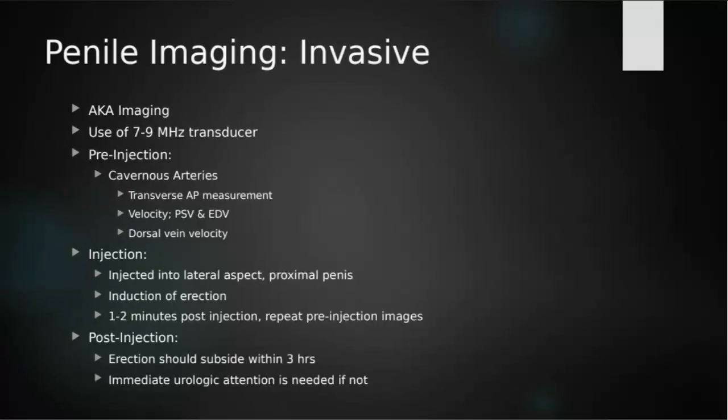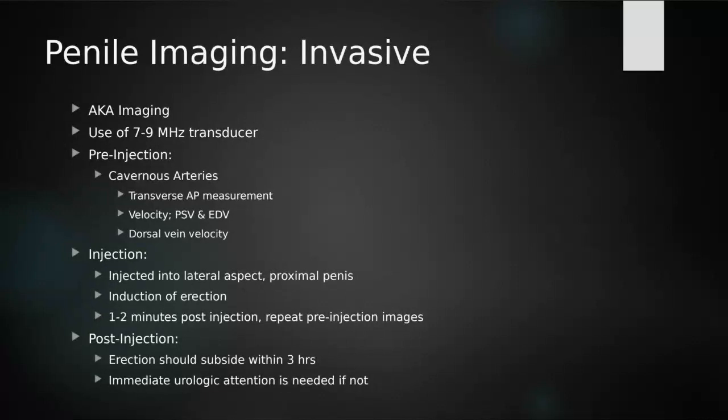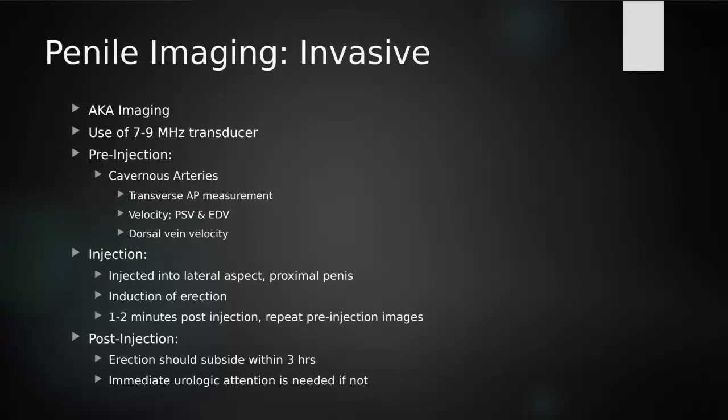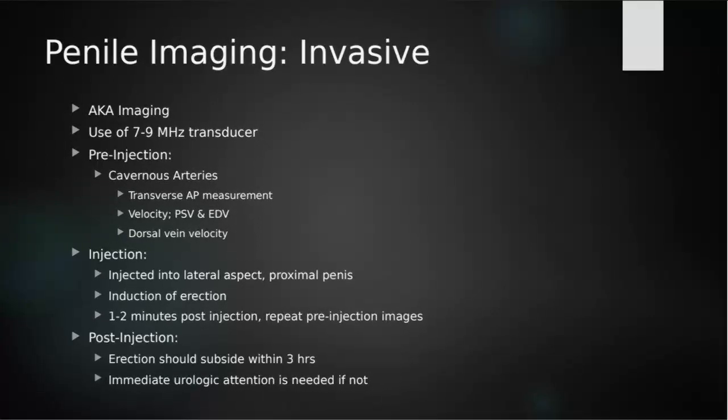We are then going to be injecting the patient into the lateral aspect of the proximal penile tissue. It's going to induce an erection, so we need to make sure that we are monitoring the time that it takes post-injection, and also how long this patient is being subjected to the medically induced erection. So we need to make sure that 1 to 2 minutes post-injection, we are repeating the images with the medically induced erection, but also, if the patient has a medically induced erection for longer than 3 hours, he needs to go to the hospital. So we need to get immediate medical attention if that is the case.